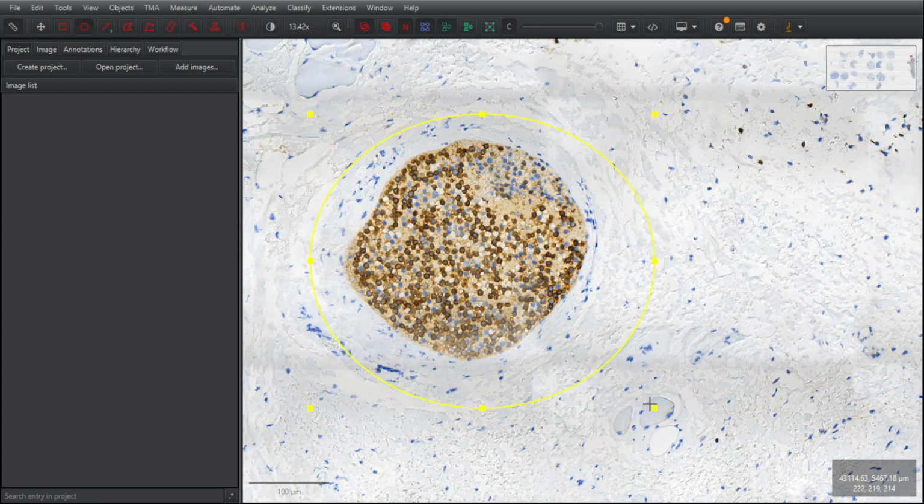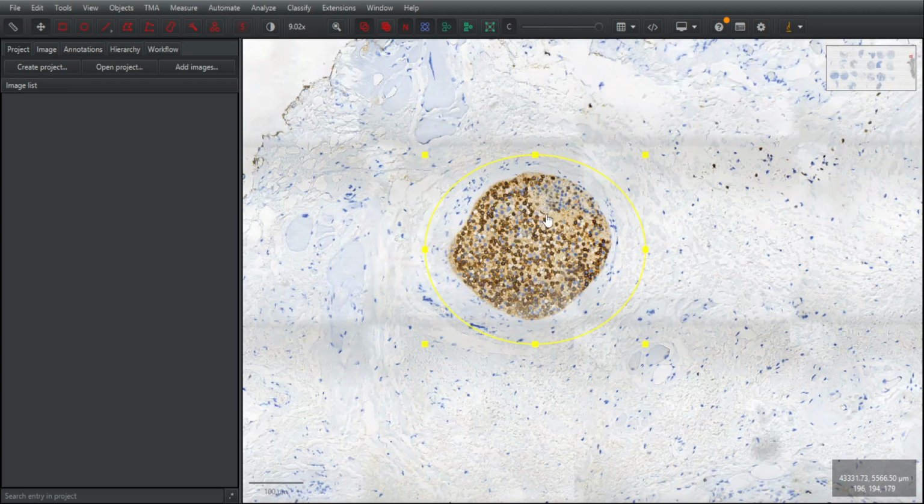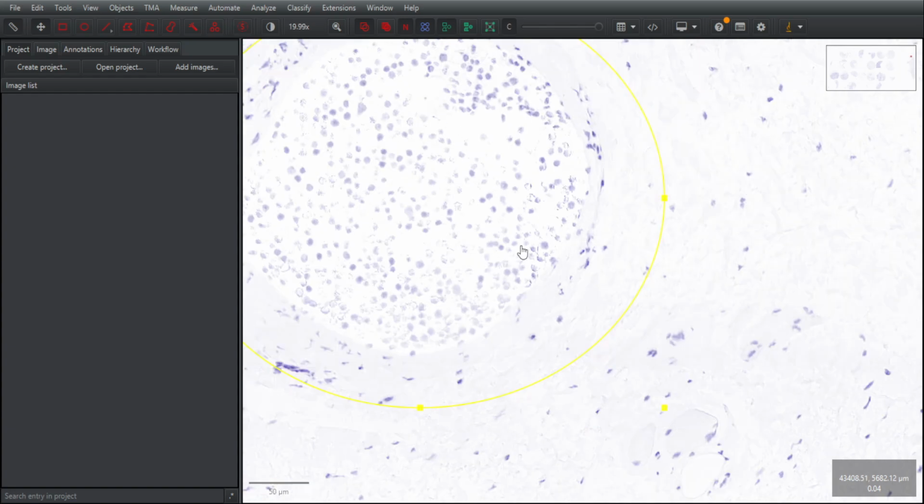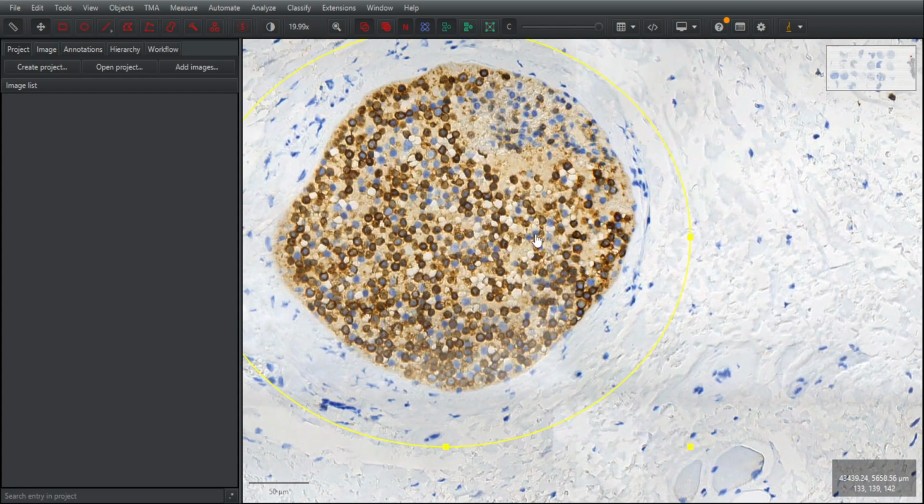Okay. So the first thing you have to do is annotate it first, and then you have to analyze, take a first look into the staining part also. Yeah. So you can see when you press 2, 3, 4, or you can just press 2, you can find the staining, different types of stains have been used. You can go to the tools, view, brightness and contrast. Yeah, there's a staining option, but I don't think you have to use that. So you go to analyze, cell detection.